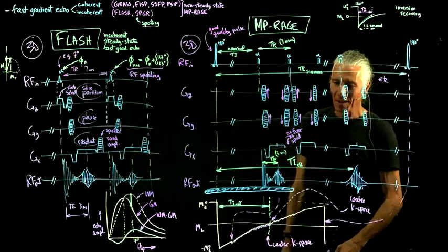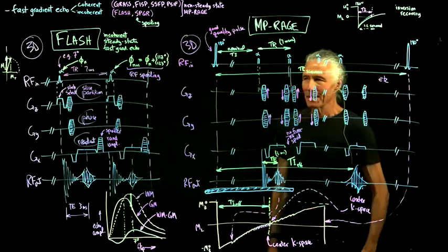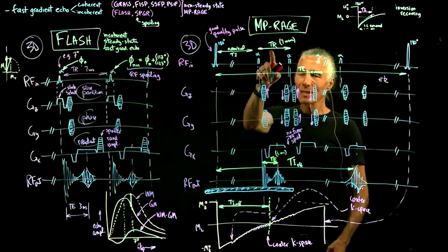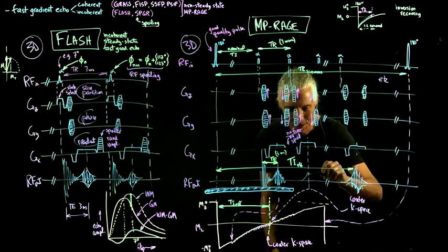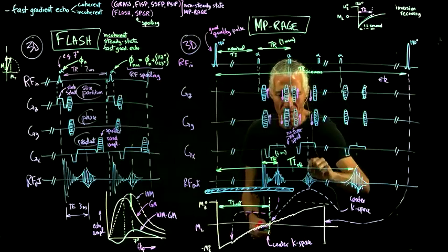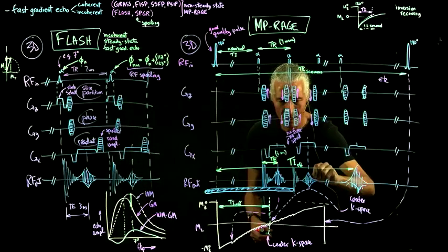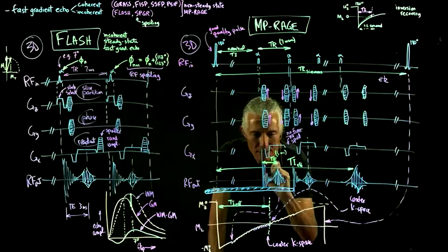And so what does Siemens call the real TR? They call it the echo spacing. So if you're on the scanner, here's the RF pulse here. So here's the FID. Sorry, this guy is FID, which we're not recording. And here's the echo.